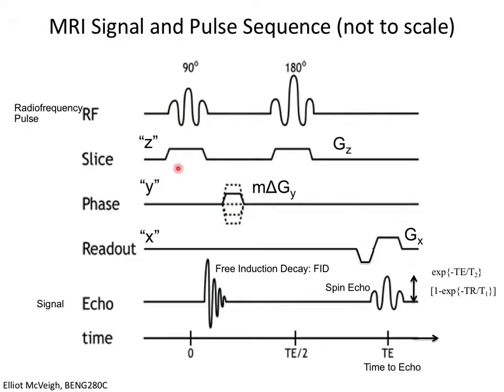let's take a look at each one of these lines and what they're doing. This is the most simple. The GZ, or the gradient in Z, when we pulse those two circular coils, creates different magnetic field strengths as a function of Z, and then we hold this current constant, so that gradient is sitting in a static form during this RF pulse.